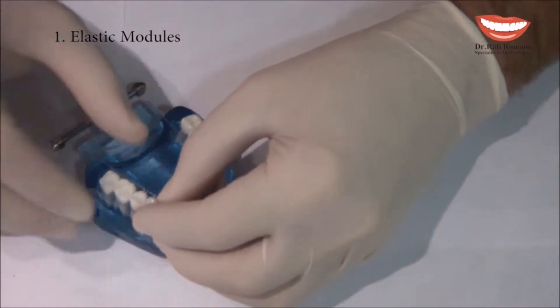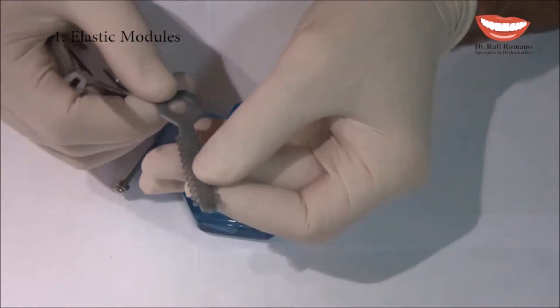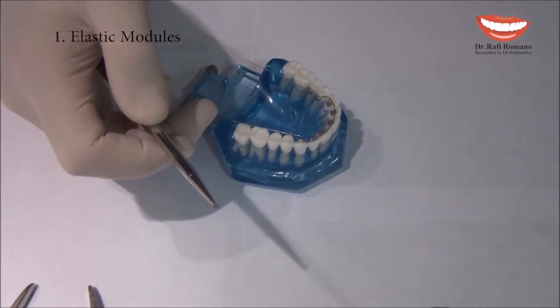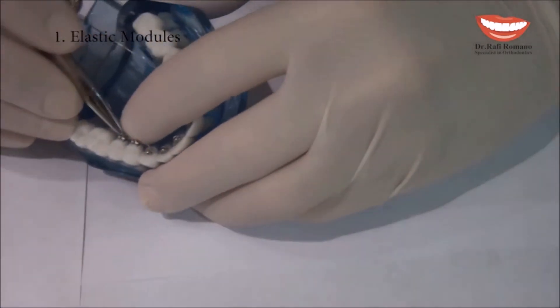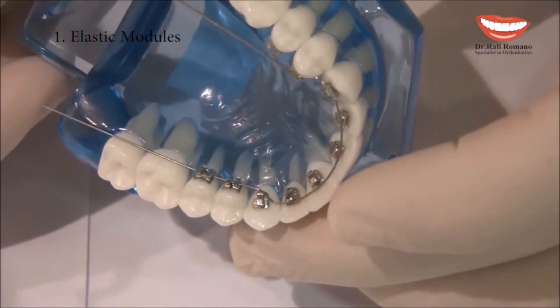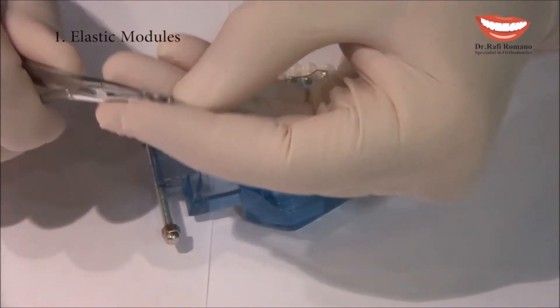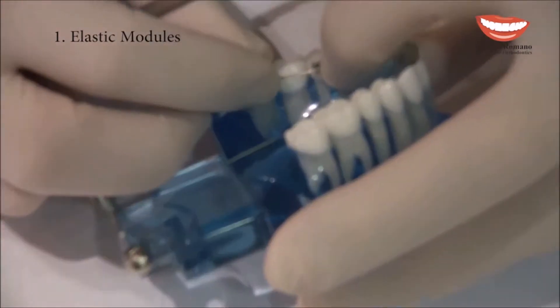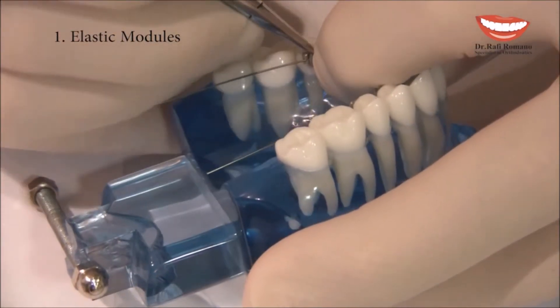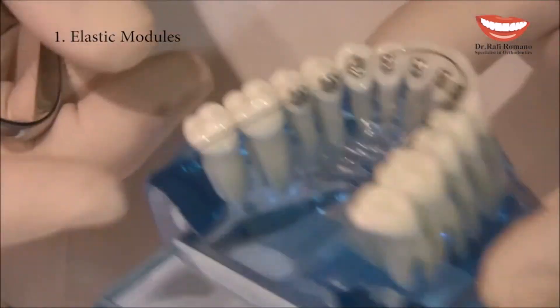In the mouth, I start by putting an elastic module on the posterior teeth. I use elastic modules which are very small and can be bought from many manufacturers. We go to one of the posterior teeth and ligate the wire, then do the same on the other premolar, going from one wing to the other like a square until the wire is nicely secured in the slot.